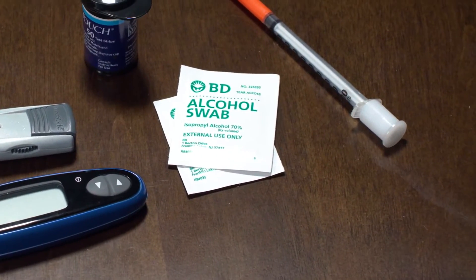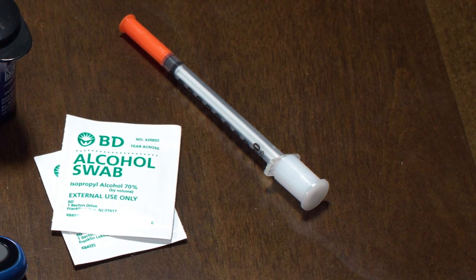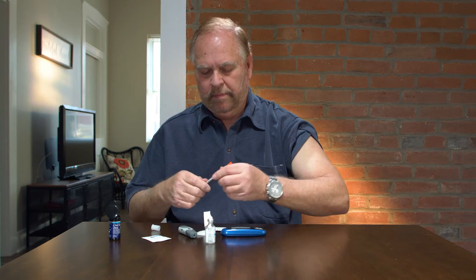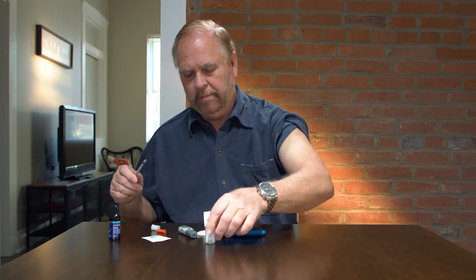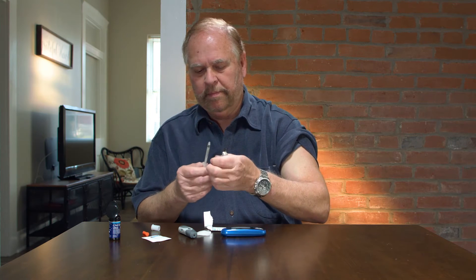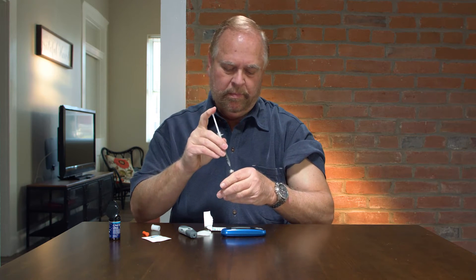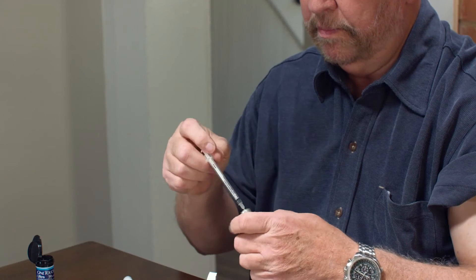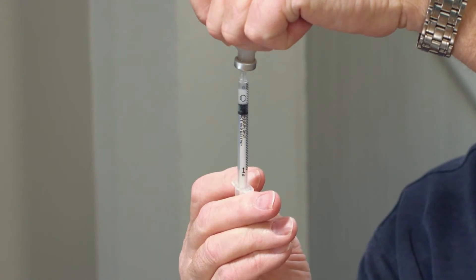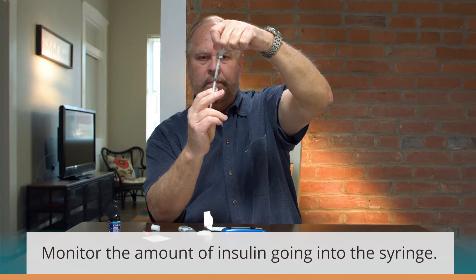Once you have measured blood sugar levels and determined the amount of insulin needed, you will fill the syringe from the insulin bottle. Carefully remove the protective shield from the needle. Give the bottle a couple of shakes to ensure the insulin is properly mixed. Pull back on the plunger and carefully insert the needle into the bottle. Depress the plunger, forcing air into the bottle. Invert the bottle and pull back on the plunger. Monitor the amount of insulin going into the syringe by watching the gauge.